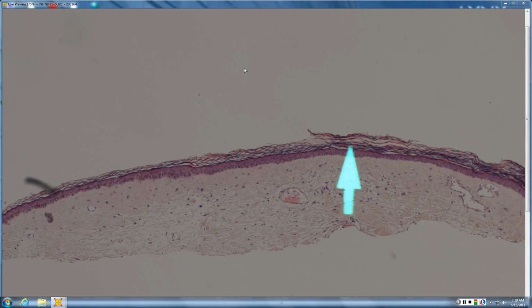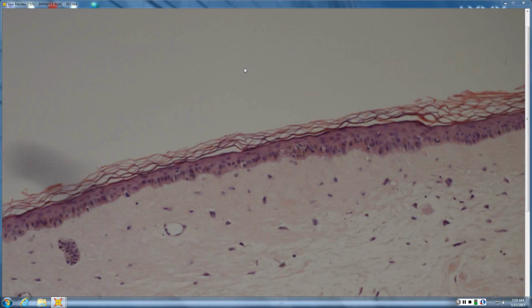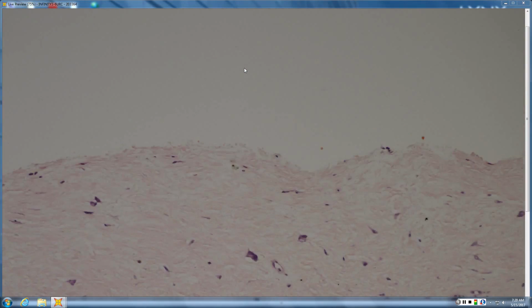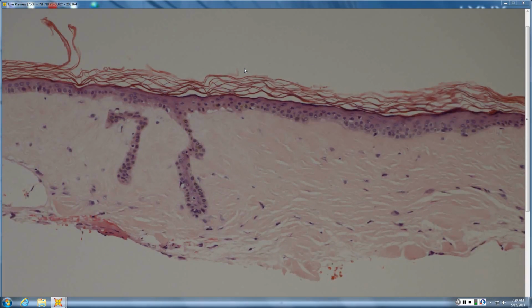And then certainly the dermis supports that sort of morphea-form appearance, sort of homogenization of that dermis, a lack of adnexae, these wildly ectatic vessels, the stellate fibroblasts. So I mean, all those features are things to look for. You can see here pretty well those stellate fibroblasts, and then that sort of vacuolization of the DJ. But it wouldn't be wrong to think of connective tissue disease, and you'd want to get some history. And the stellate fibroblasts certainly point towards radiation and the lack of adnexae. You can still see the arrector pili muscles, though.